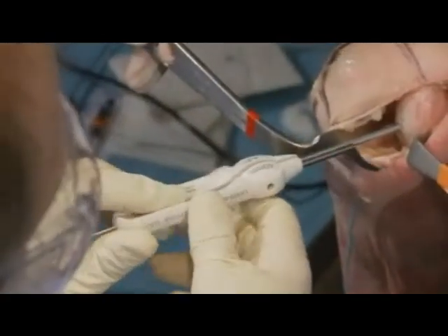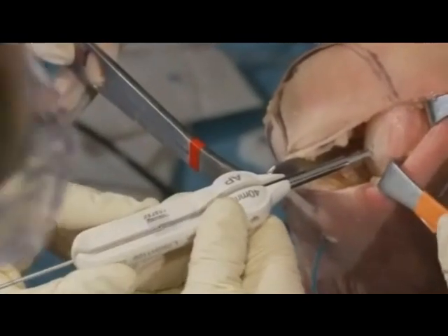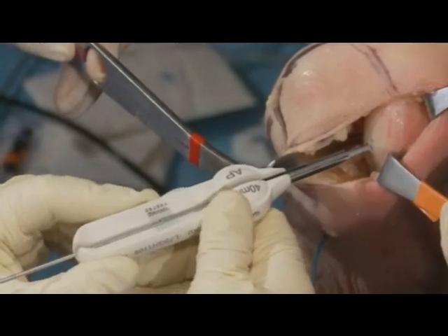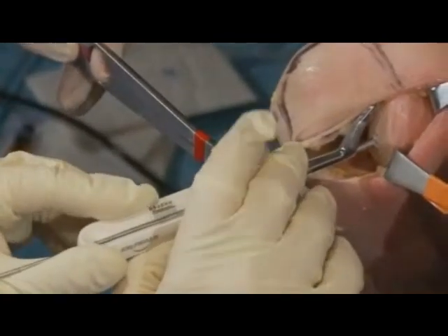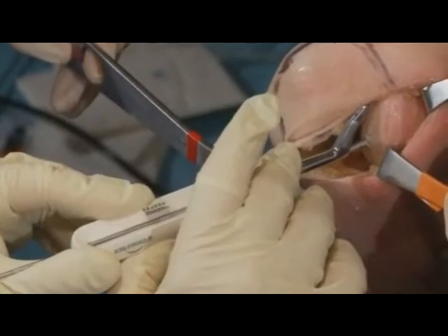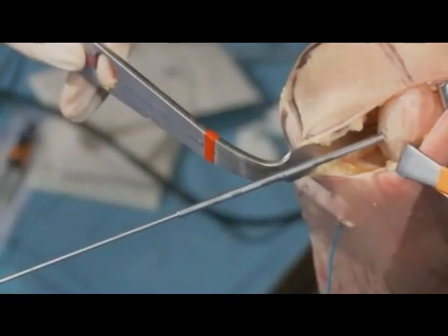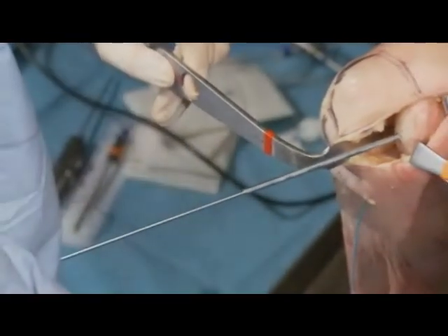Now this device is a 40 millimeter device, and it's going to measure the AP length. So what I like to do is first flex the knee up, make it touch at the bottom. Can you see that number? So we have a 7. And a 7, so that we have a 7 curvature, and the 7 curvature is from anterior to posterior.